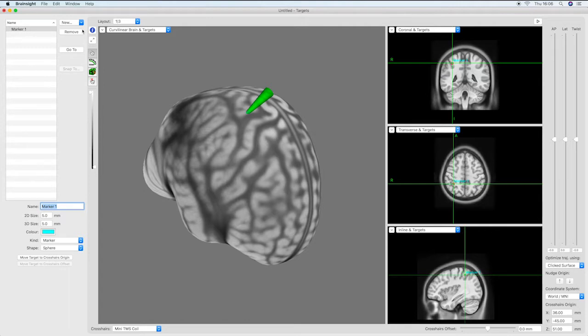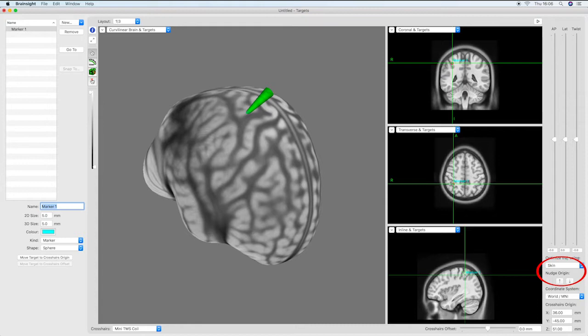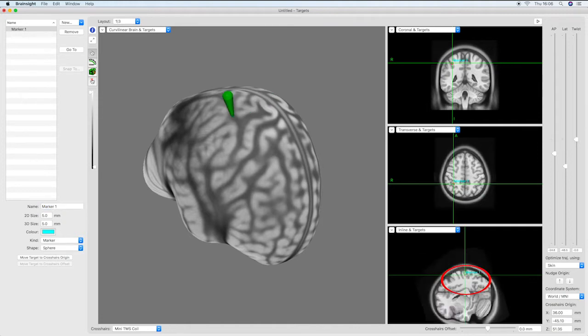Brainsight allows the trajectory to be defined automatically or manually. To automatically optimize the trajectory, select skin in the optimize trajectory using option, then click on the center of the crosshair on the MRI view.